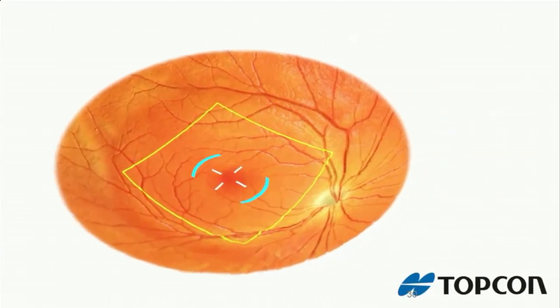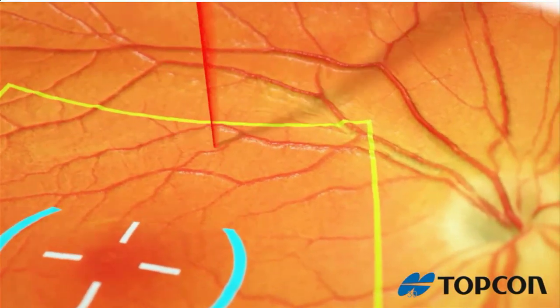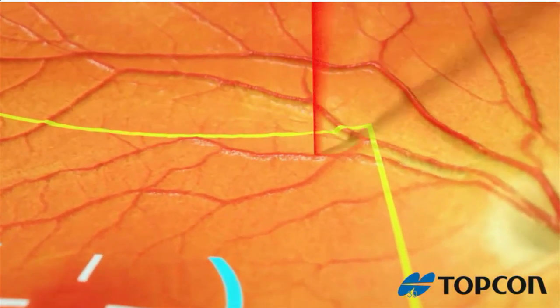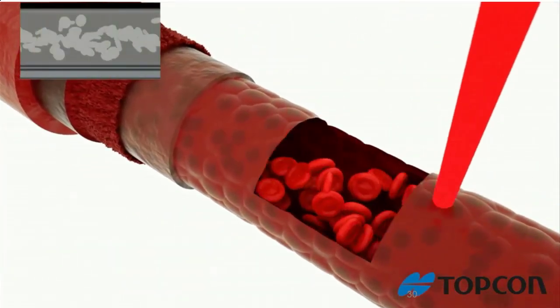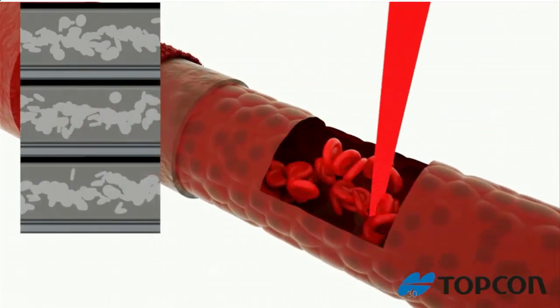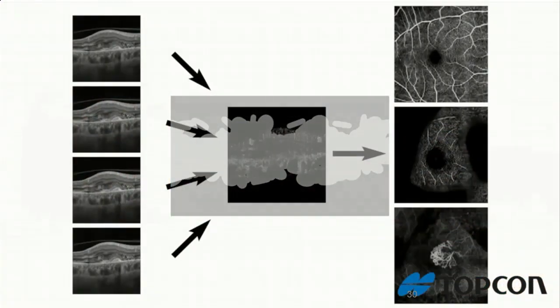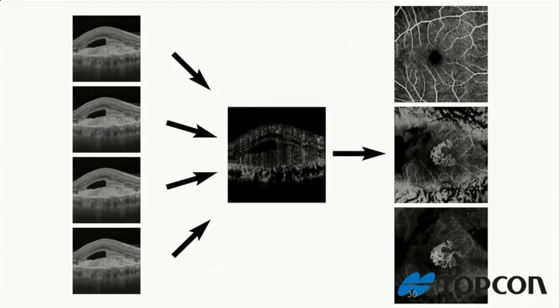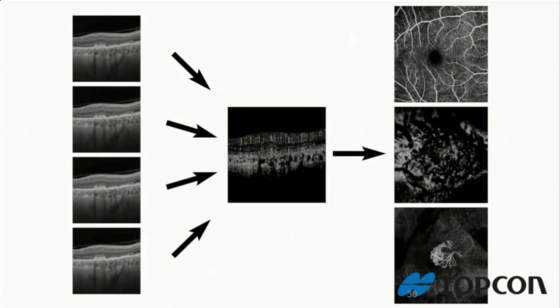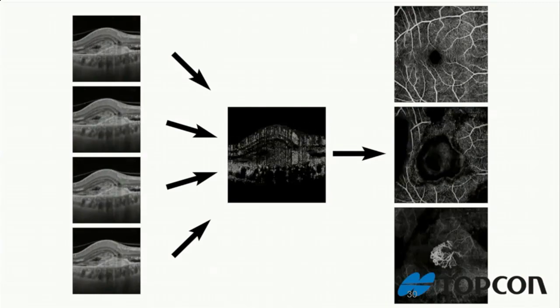So this is of my right eye that I got from a fundus image. And the scan goes over the vessel 4 times. And then it captures all of the OCT information about the vessel, the moving erythrocytes, and the stroma. Then it does a sort of subtractive ratio analysis, and it's left with only things that are moving. So that's the general explanation of OCTA in a very simplified way. The question is, is this really understandable?